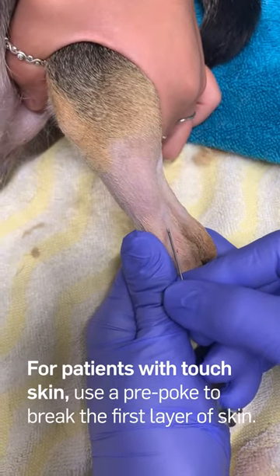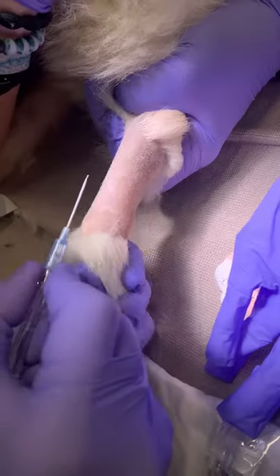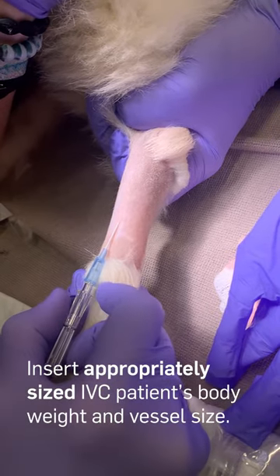For patients with tough skin, use a pre-poke with a fresh needle to break the first layer of skin, avoiding the vessel. Insert an appropriately sized IVC for the patient's body weight and vessel size.